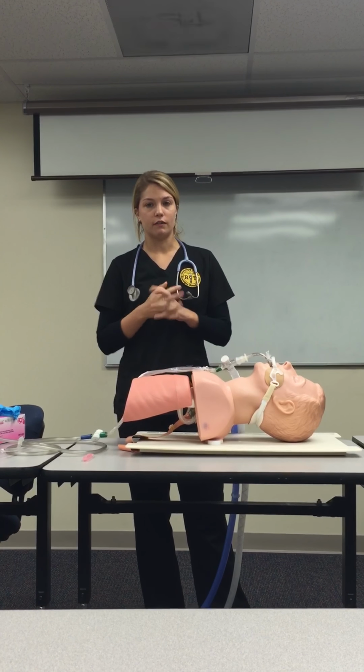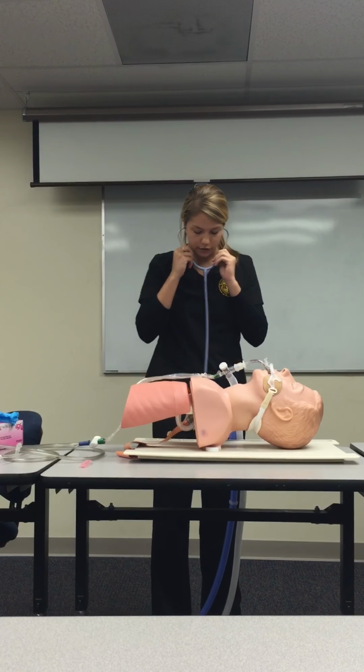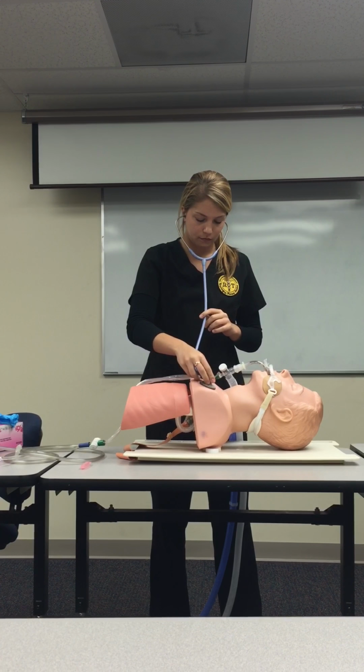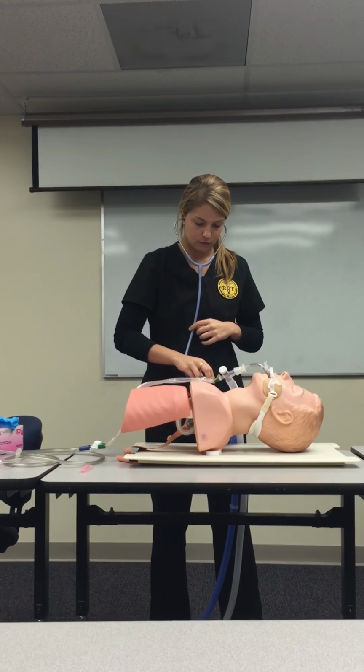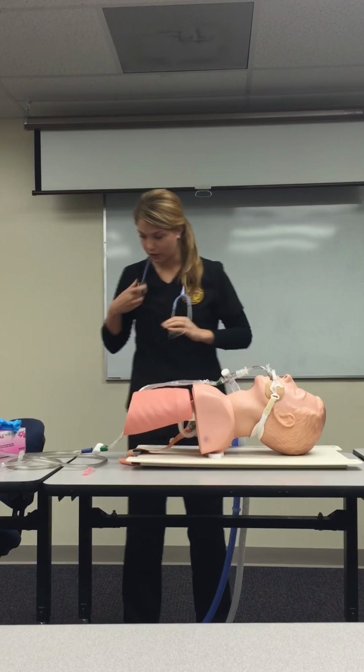Then I would check his vital signs, see how he's doing, and then I'm going to listen to his breath sounds, see if he actually needs to be suctioned. And he does sound coarse, so we are going to suction him today.